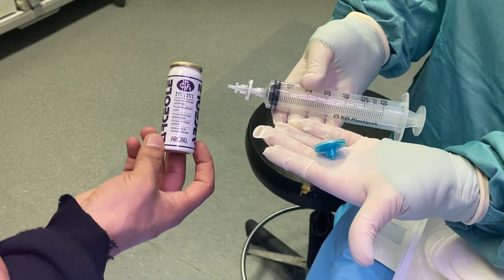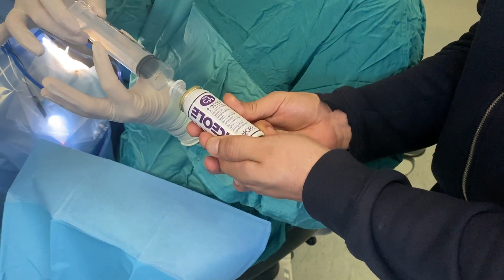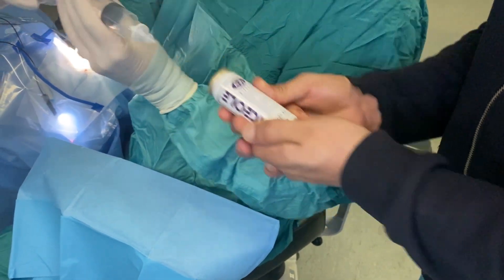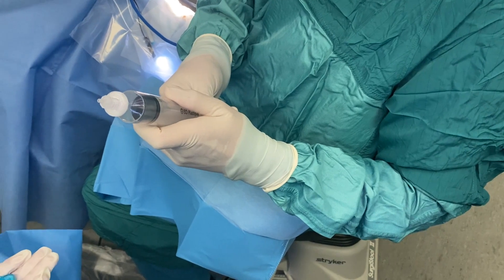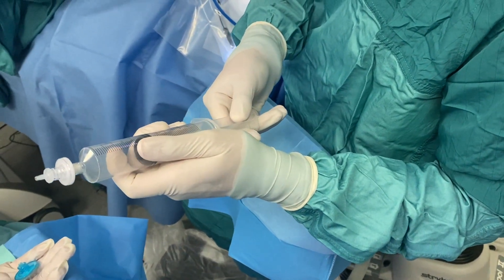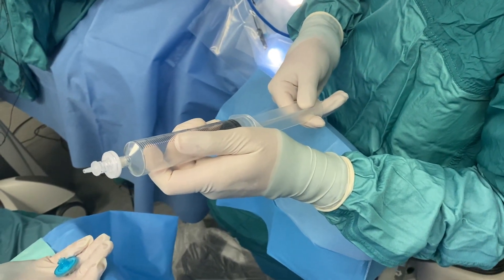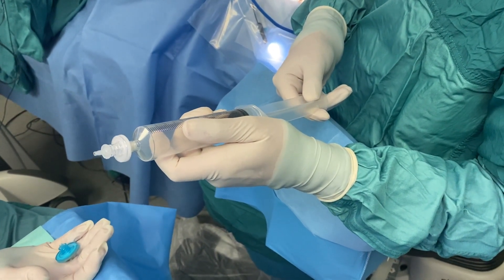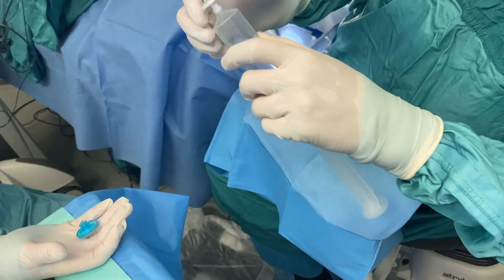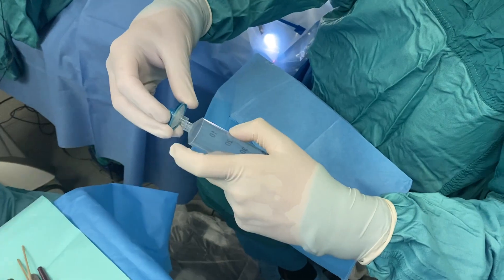The second technique consists of direct aspiration of pure gas through the filter from a one-time aluminum gas cylinder, and then dilution with room air. While preparing gas for injection, it is recommended to use a filter during aspiration to prevent contamination. Some surgeons, for extra safety, switch to an additional filter before injecting the diluted gas into the eye, as you can see in this video.